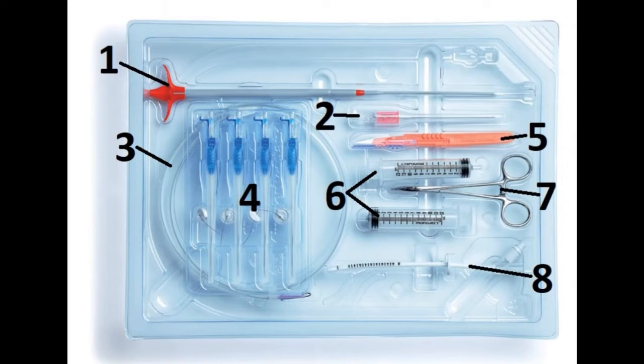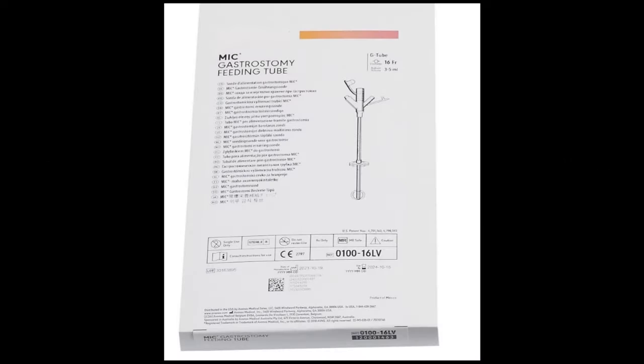From number 1 to 8, we have: the serial dilator, a guide wire introducing needle, a guide wire, four T-fasteners, a scalpel, two syringes, a forceps, and a stoma measuring device. And this is the gastrostomy feeding tube.